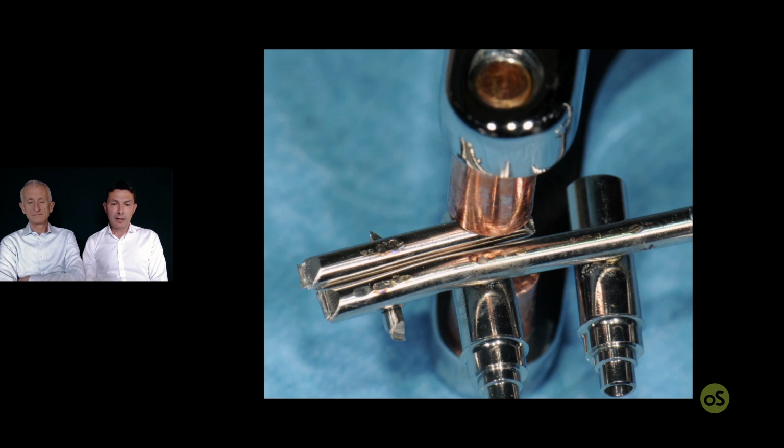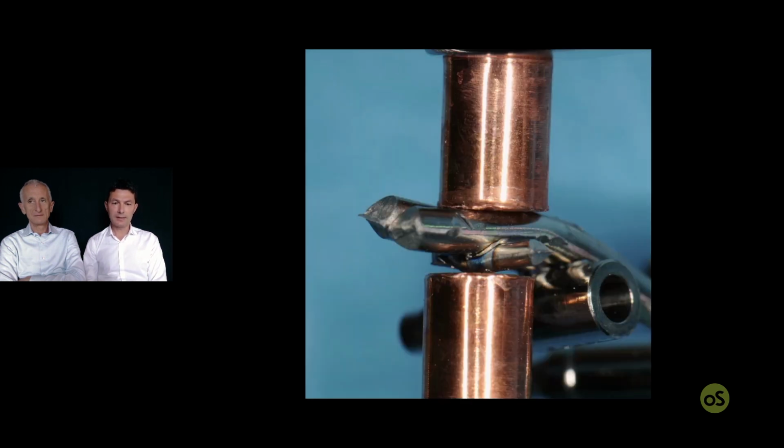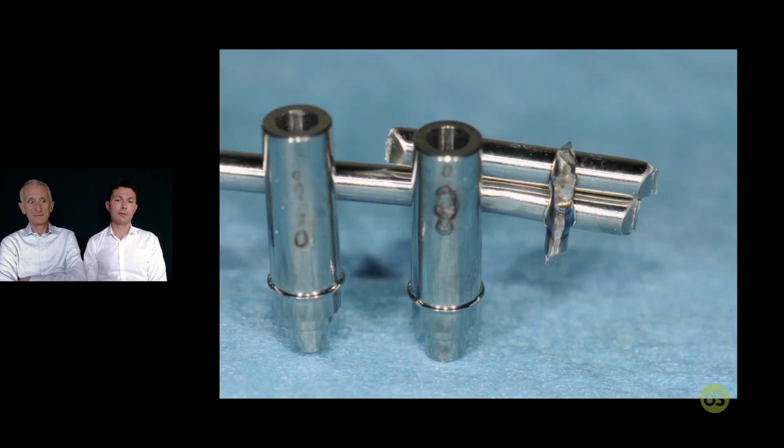And if you have a cantilever, it's time to increase the framework in the cantilever with a second 2 mm of wire in the last abutment in the direction of the cantilever, on one side and also on the other side, if you have 2 cantilevers.